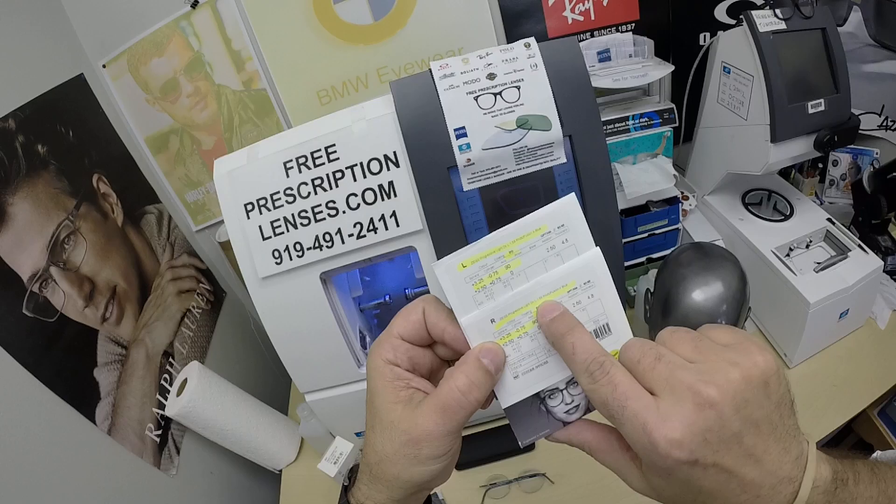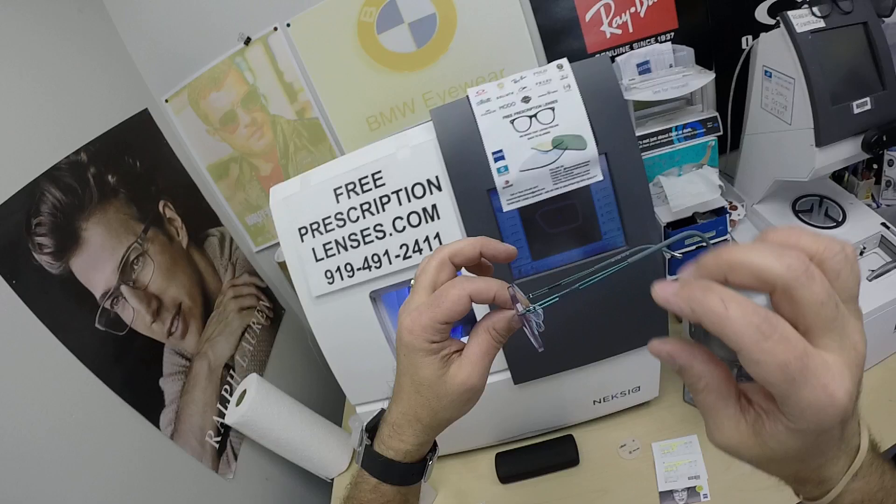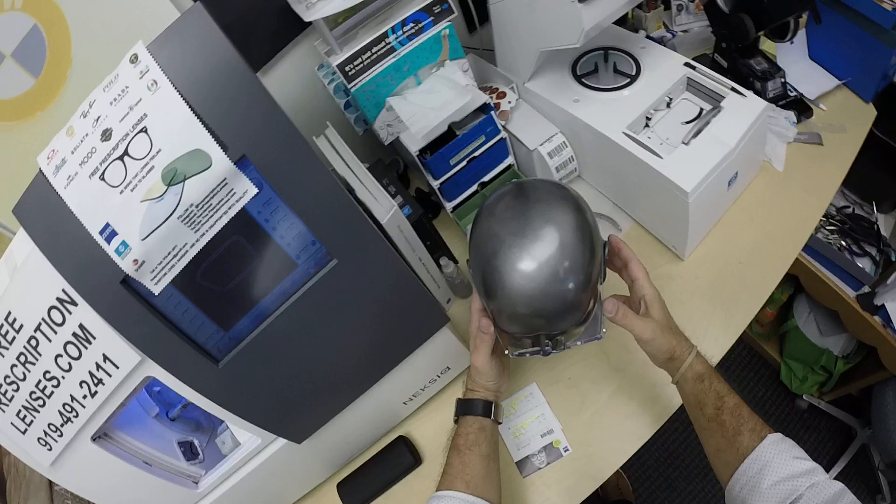She got the Zeiss Light D in polycarbonate, Photofusion Blue — my favorite color — with DuraVision Silver anti-glare. I have highlighted the prescription for the right eye, same for the left.